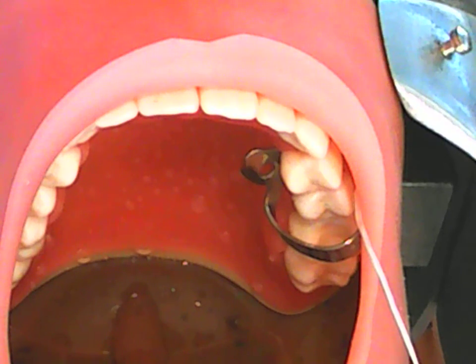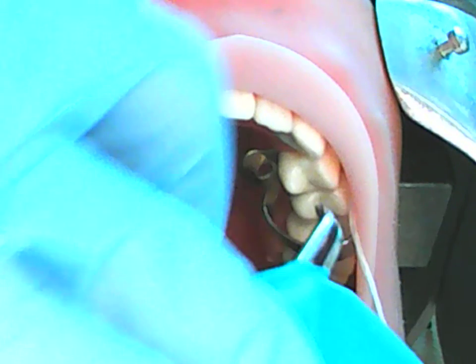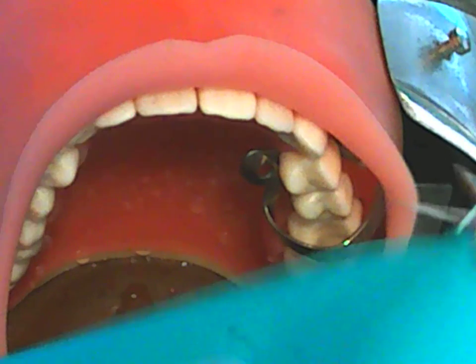Okay, you are ready to apply the actual dental dam now. You are going to begin by passing the floss through the key punch hole of the dam. How you do this is you line up your dental dam and orientate yourself. There's the key punch hole. You're going to place your cotton pliers through that hole, flip the dental dam back over, and retrieve the floss that's attached to the clamp with your cotton pliers. Flip the dam back over. This will come through for you, like so.